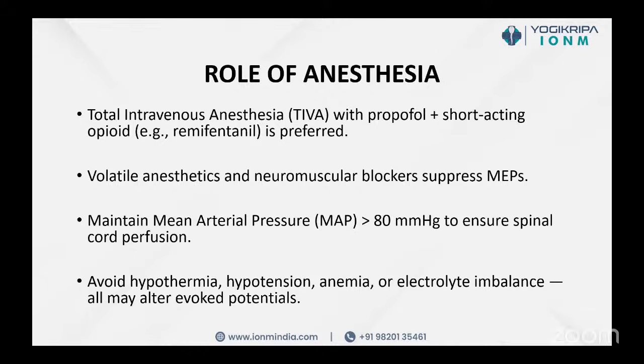The mean arterial pressure has to be above 80 to ensure cord perfusion. If the signals have dropped generally, then you have to keep an eye on the pressure and see. If the pressures have dropped, then request the anesthetist to maintain the mean arterial pressure.